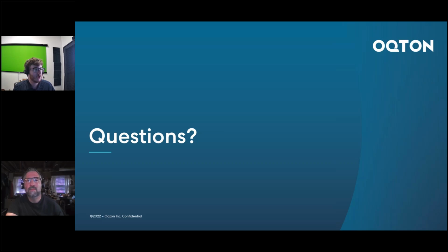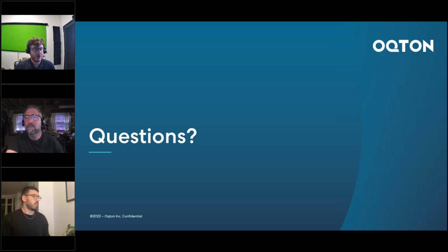And with that, we'll open up the floor to a Q&A. Please feel free to ask any additional questions. At this point, we've talked a lot about the scanning side of it, moving over into processing that scan data, what it's like to sculpt around it. So a lot of information. Hopefully it alleviates some of it, but we'll open up to some Q&A for additional questions that people might have.